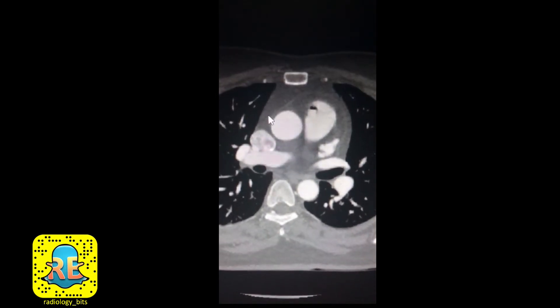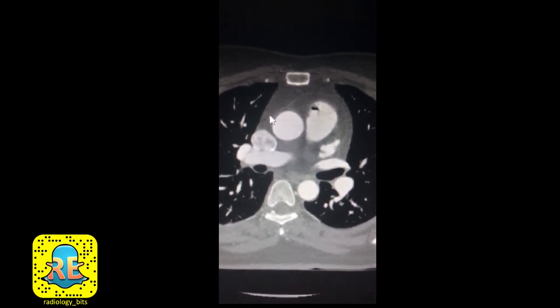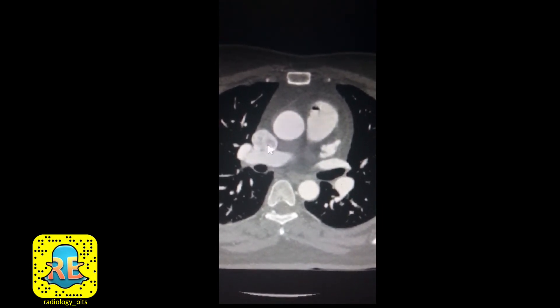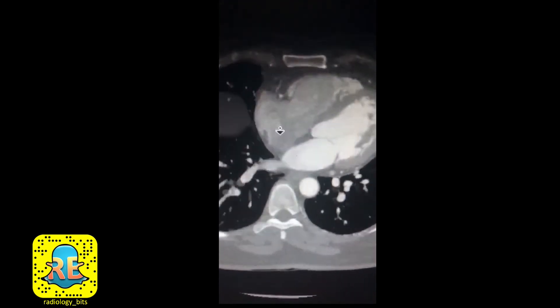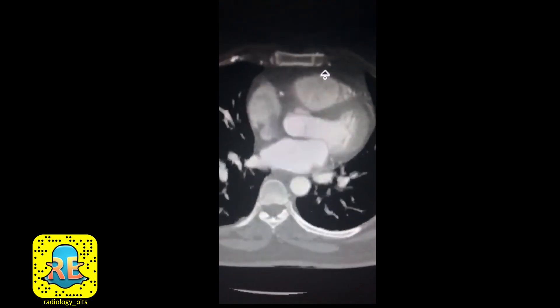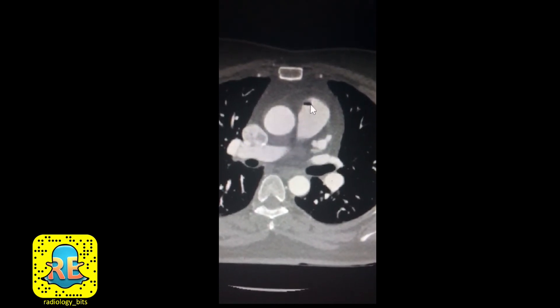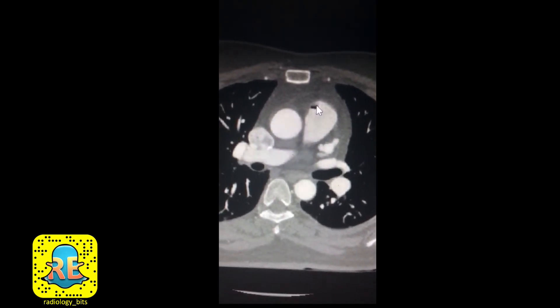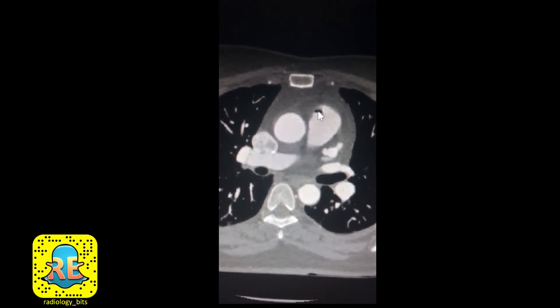To clarify this: if you insert an IV line, occasionally you might have air bubbles tracking into the veins. The veins drain all the way back to the SVC — the superior vena cava — which then drains blood into the right atrium, which drains it into the right ventricle. That's why you see a tiny air bubble there as well. The right ventricle pushes blood into the pulmonary artery, which could contain a few air bubbles. This is normal. A few tiny air bubbles secondary to inserting an IV access is not an unusual thing — this is not an air embolism; it is a finding to ignore.